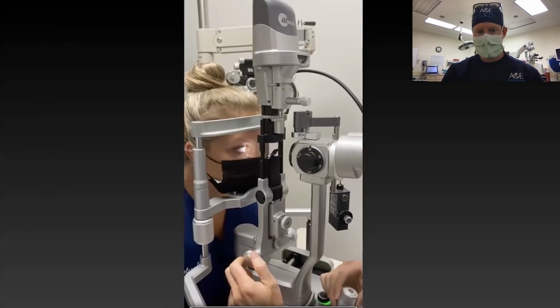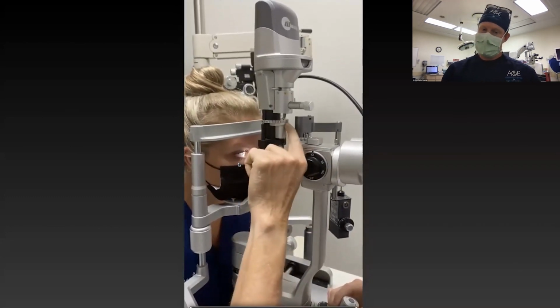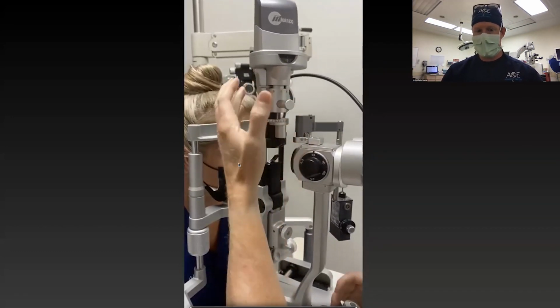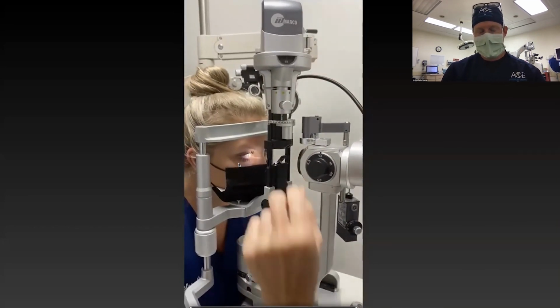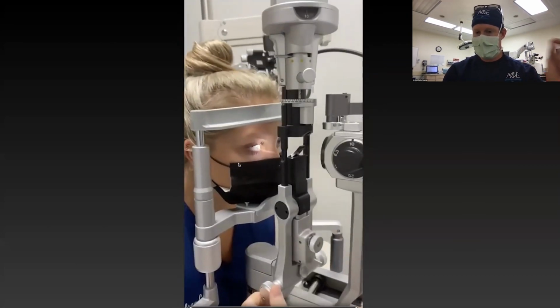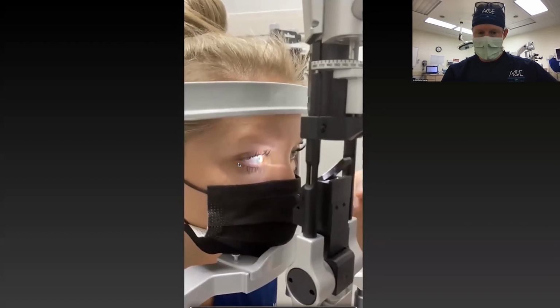So this is a Haag-Streit type slit lamp. And what I'm showing here is if you have a patient sitting upright, you can use the slit beam and you can put the slit beam on the intended axis of implantation that you got from your toric surgical plan calculator. And then once you have that slit beam centered on the pupil, you can now mark the eye. Now, if you have your slit lamp near your operating room, you can just use a marking pen and you can mark the ends of that slit lamp beam right at the limbus.